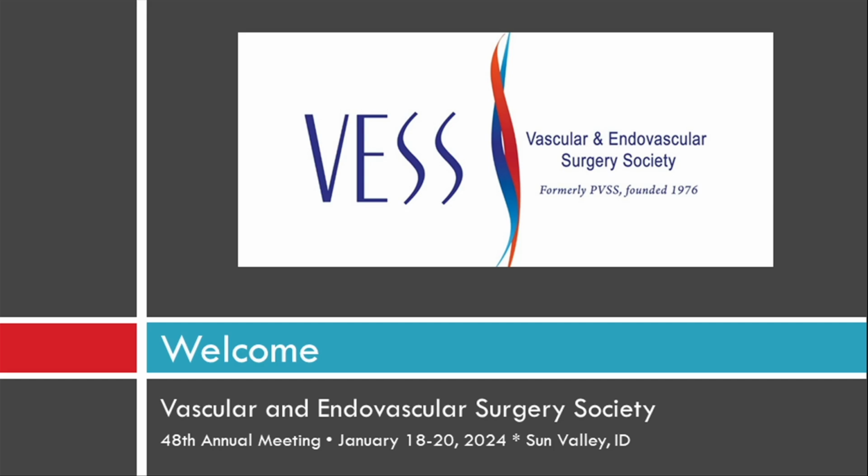Absolutely. Yes, so with the second question first, absolutely. In the arterial HUR, we're just comparing false and true lumen at every zone, so you're sort of canceling out any differences in timing because you're just comparing lumen to lumen. That accounts for cardiac output, contrast timing, contrast dose, et cetera. When we compared two different phases, venous to arterial, we normalized each to the root to try and get a sense of that as well. Now, you could get really detailed and talk about how there's different compliance of the aorta, and that's going to deliver contrast differently, but we weren't able to do that level of granularity.